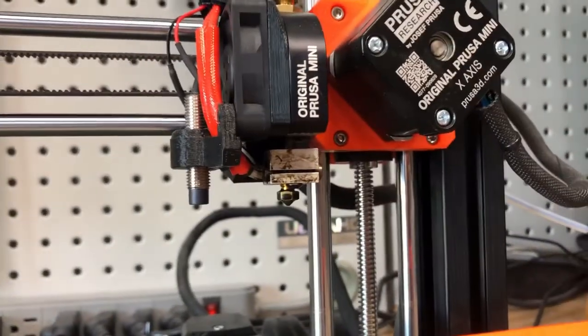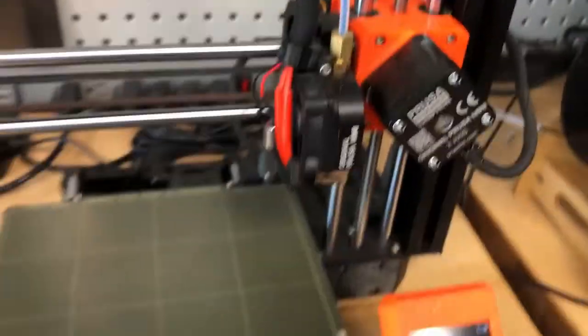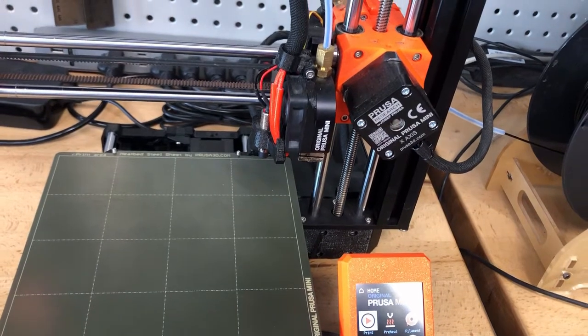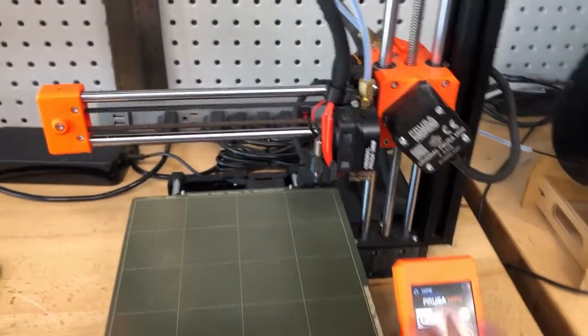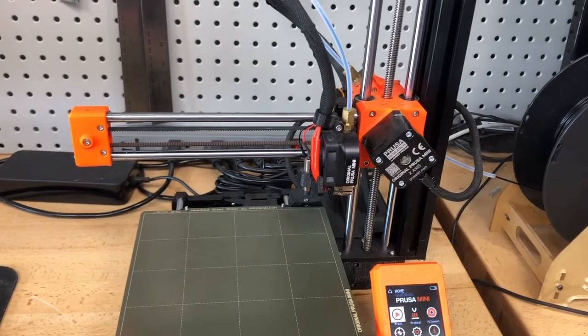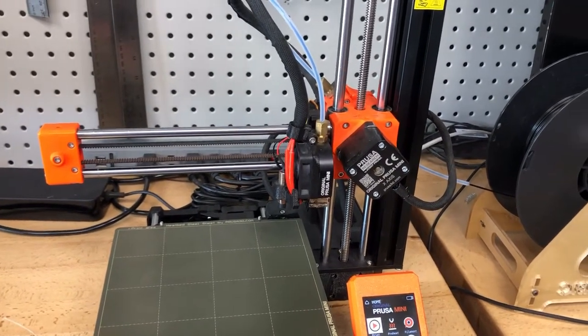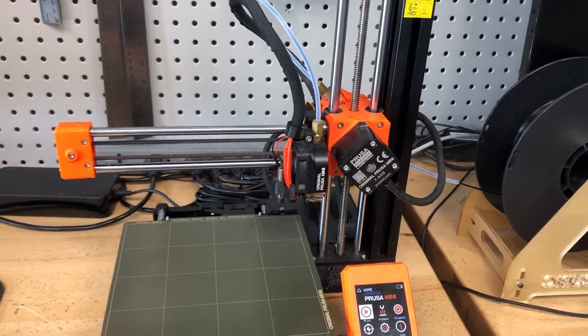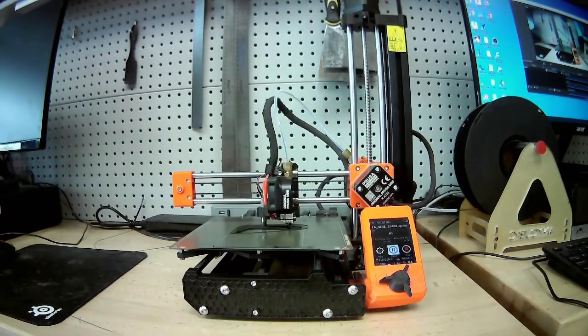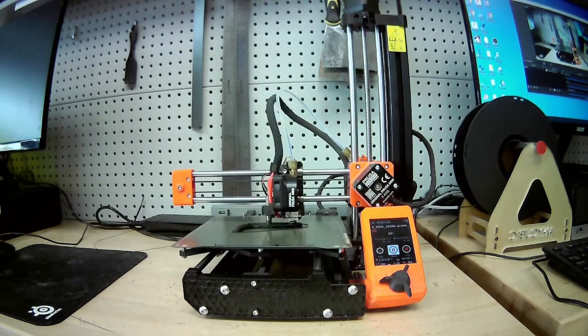This is the piece that actually heats up and melts the filament into this hot, pliable plastic that can be stacked on top of each other using those slices that we made previously. The printer will then start an initial layer and gradually begin stacking these slices until the object is complete. Once the object is complete, you can pull it off the bed, remove supports, clean it up if you need to, and use it as you intend to.